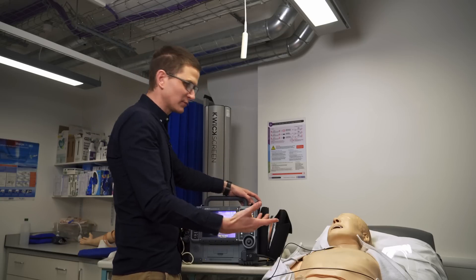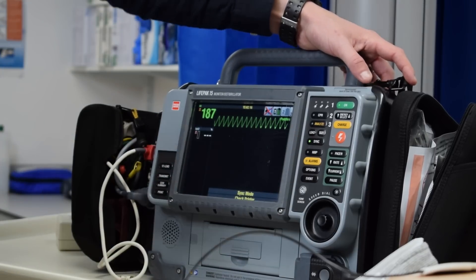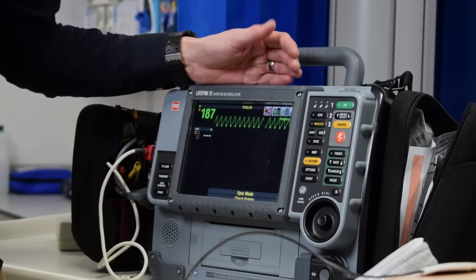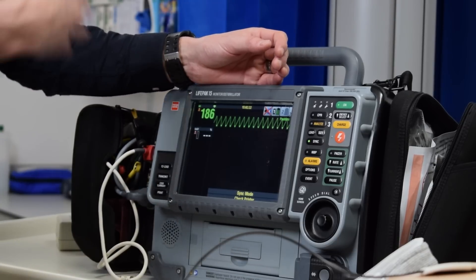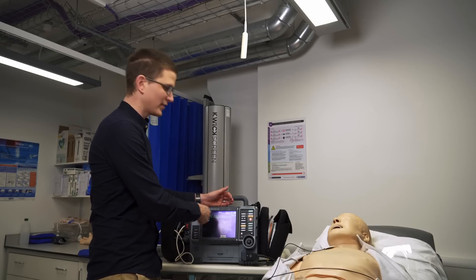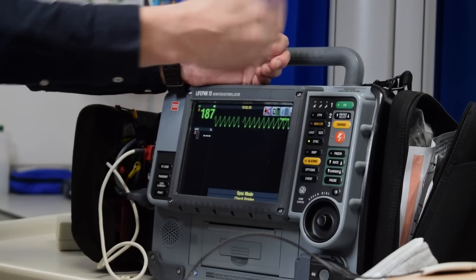The most important thing is that we need to hit sync. The sync button is us telling the machine: you tell us when it is safe to shock. Because we don't want to shock on a T wave or anything like that. The machine puts little dots next to each of the QRS complexes, so it then knows when it is safe to shock.